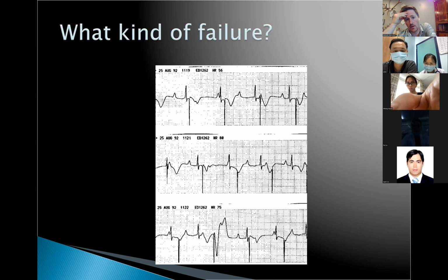So this would be kind of a failure to sense. And the reason I say that is because we can see down at the bottom these pacer spikes that are occurring too early, in the refractory period of a patient's native beat. So this is failing to sense the patient's native beats. And so maybe the sensing is not sensitive enough, and so it's not sensing the patient's native beats and it's firing a pacemaker spike at an inappropriate time.